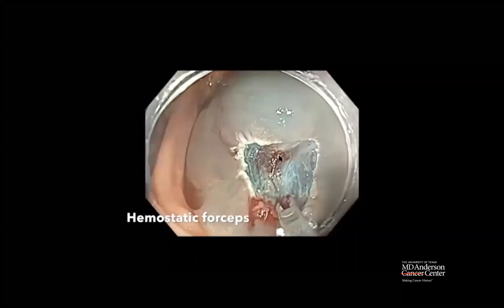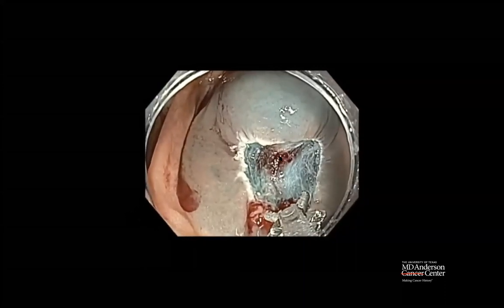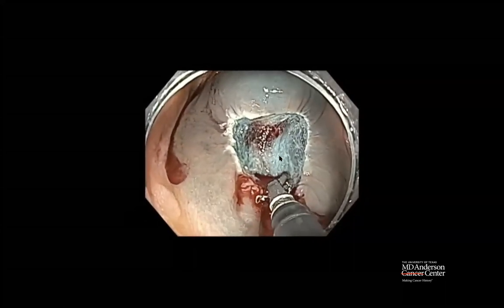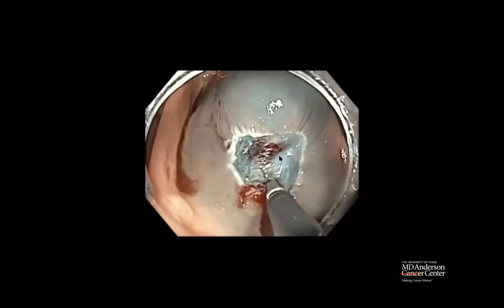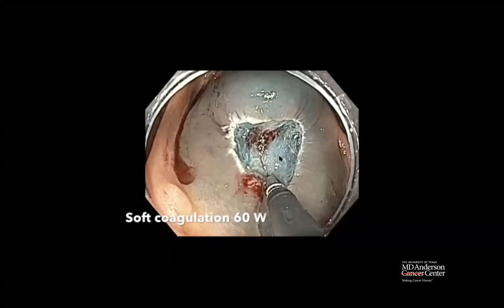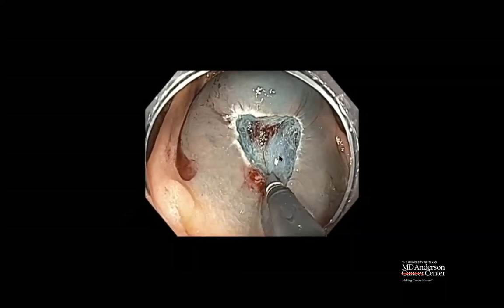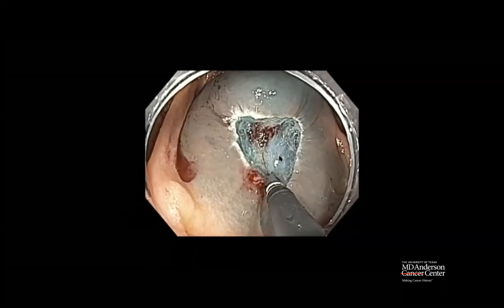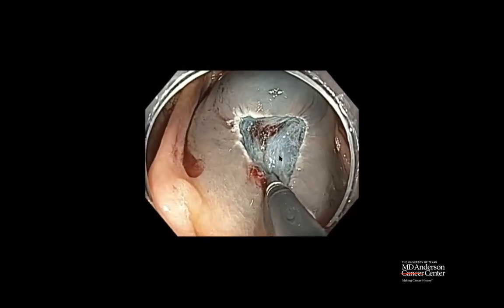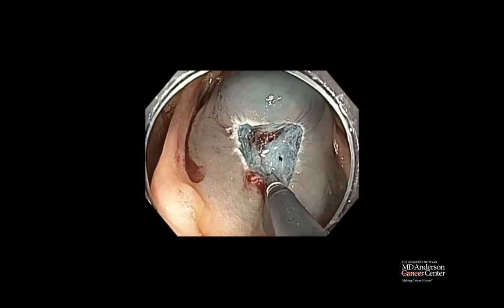So here is the hemostatic forceps that I'm using. We used soft coagulation. Basically, you could see the bleeding spot nice and easy. Close, and make sure that the bleed stopped before you apply current. So we applied soft coagulation at 60 watts. You can go from 60 to 80 to 100 watts.